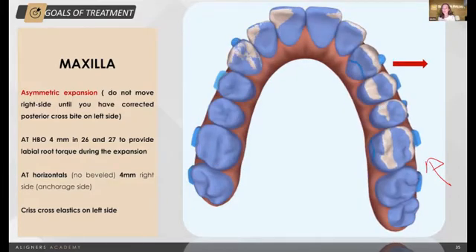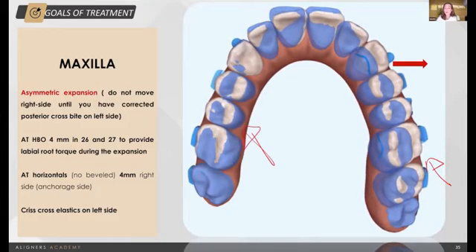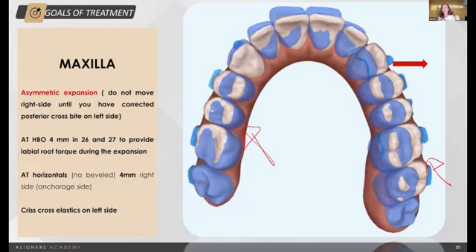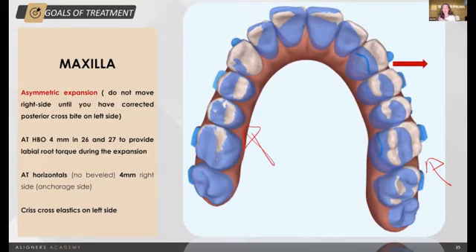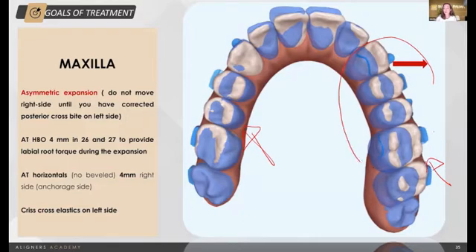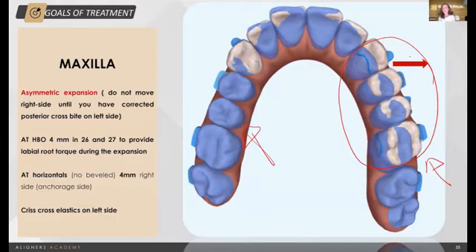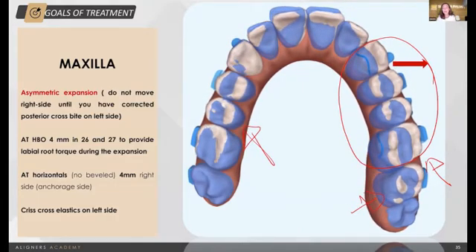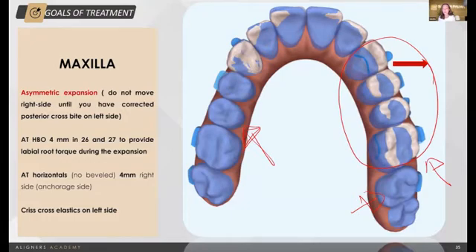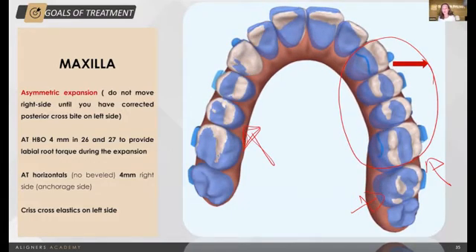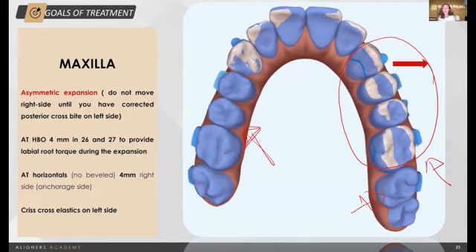We are going to use the side without crossbite as anchorage. We are going to use a horizontal attachment on the right side — not bevel — in order to have the aligner grabbing during the correction of the posterior crossbite. We are going to ask for expansion from 3 to 6, and once that is completely corrected, we will start moving the 7 and the anchorage side. On the side of the posterior crossbite, we are going to use horizontal attachments beveled to gingiva in the premolar and beveled to occlusal in the molar, because we are going to ask for labial root torque of the molar during the whole expansion movement.